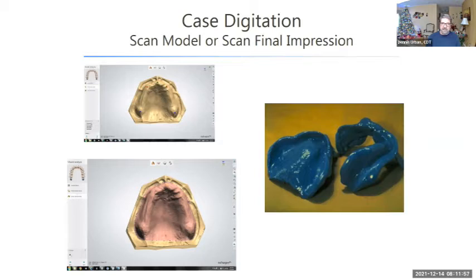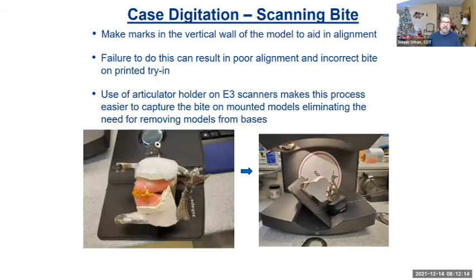So we scan the final impression or the model. And I have to say, most of the times in the laboratory, we're scanning models, and the impressions work out fine, but I like scanning the models when we have them in the laboratory. And sometimes we do both. And then we pick the best scan out of all of those, which is great. So once we scanned that impression and the doctor took a bite registration, that comes back to the laboratory. That's on the 3rd visit.